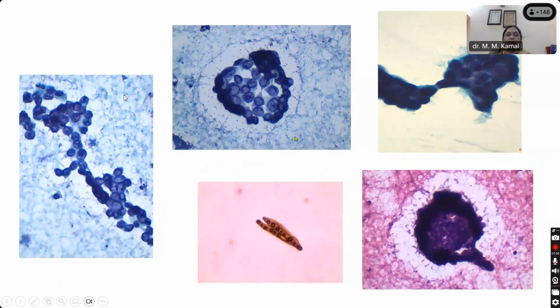Yes, ma'am. And the background is appearing somewhat foamy or necrotic. No, the cytoplasm is foamy, the background is necrotic, so it cannot be foamy. Okay. What is this you're seeing? It's just a trail of cells. A trail of cells showing some amount of branching. Not exactly extension of those trails, and they are known as peas in the pod.